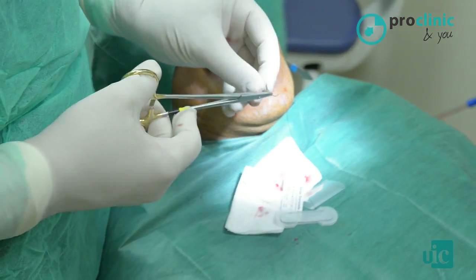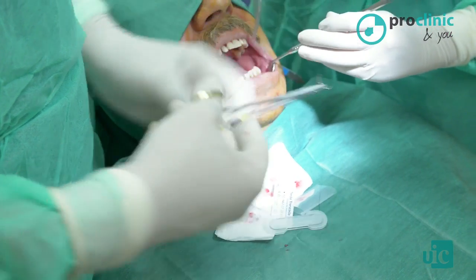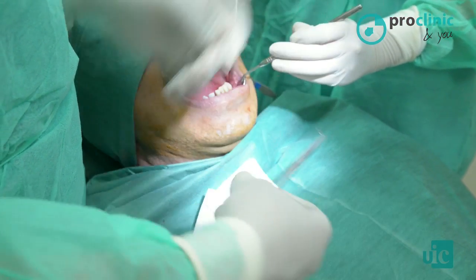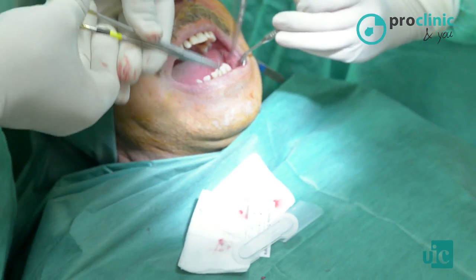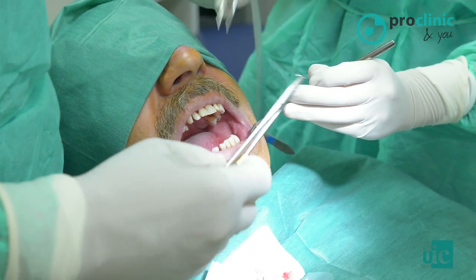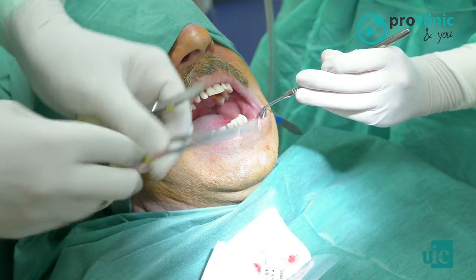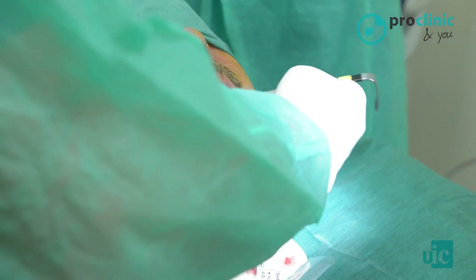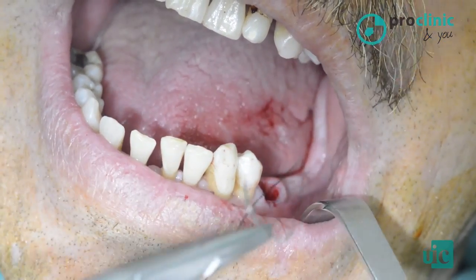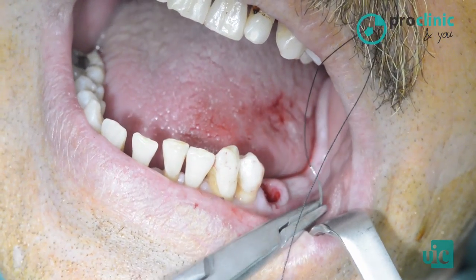Needle. This one has a semicircular needle, and we catch the needle holder at 90 degrees at the tip. This would be the position. Dissection, without teeth. We should try to be less aggressive, and this is why I prefer the Farabeuf retractor instead of an intraoral mirror. The Farabeuf retracts the lip. And this is the position in which we have to place the suture. All right?